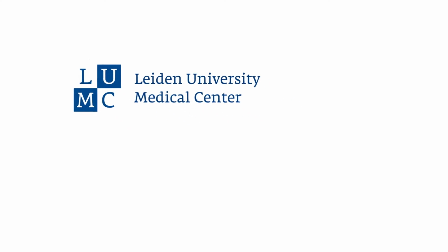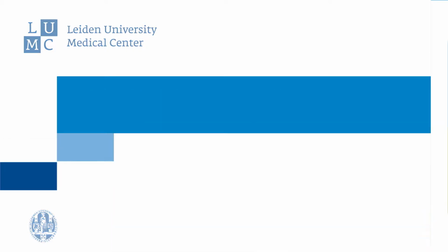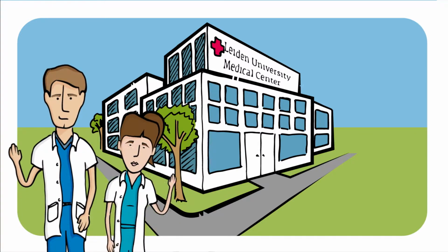E-learning tumour-stroma ratio. 2 minutes for a better prognosis with colon carcinoma. Dear pathologists, we appeal to you to help us with vital and promising research.